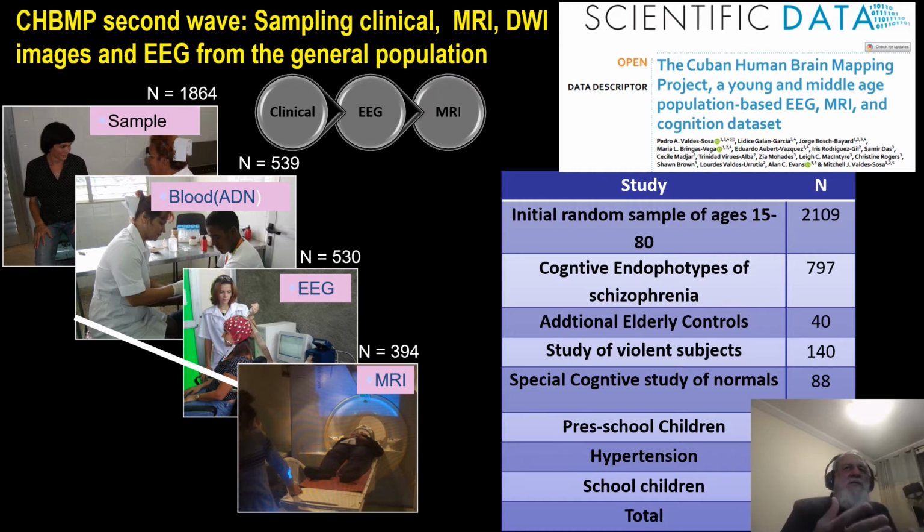in a second stage to try to analyze a multimodal database. So we gathered a second set of EEGs. This here is, you see here, we're sampling, let's say the family nurse is sampling in the general population, once again chosen at random, stratified sampling. We have blood tests frozen for then subsequent DNA analysis. This is at that time a higher resolution, spatially in this case, of EEG.